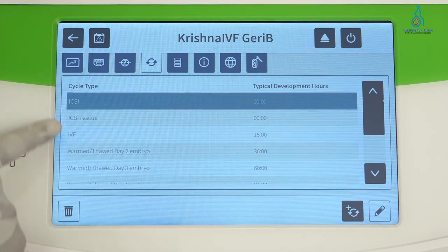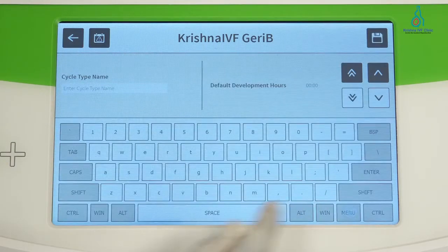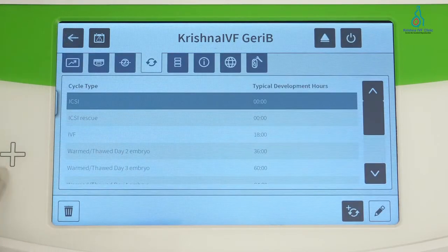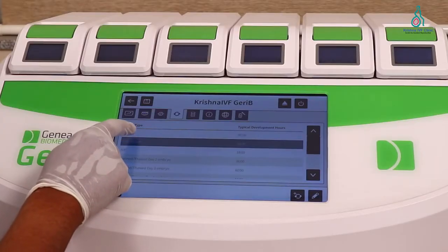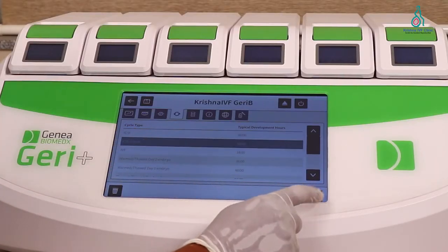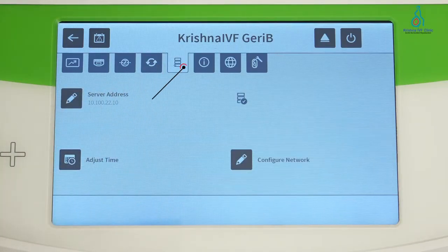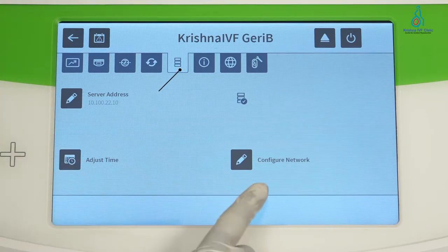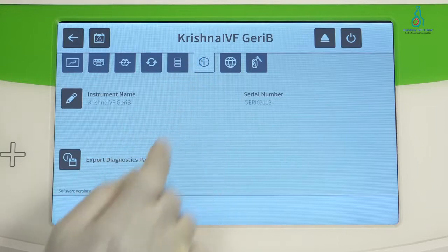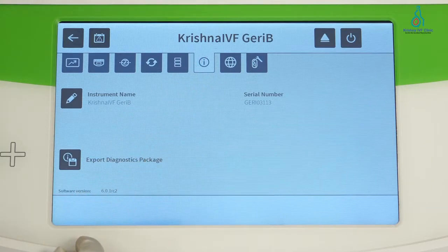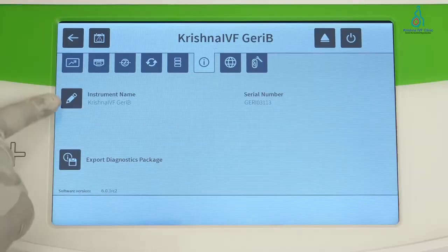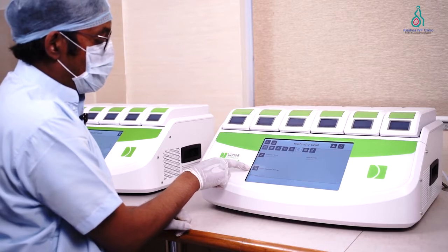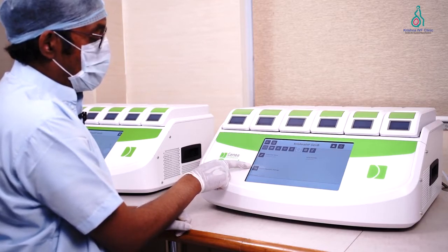Here the cycle types are listed — those already created are shown. If we want to add a new one, we can do it from here. Selecting any existing cycle type shows the server address of the JRE server and date and time adjustment. This screen also shows instrument name information. If we want to download logs, we can use this key to export the diagnosis report.